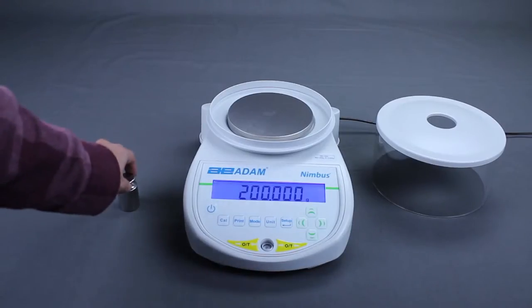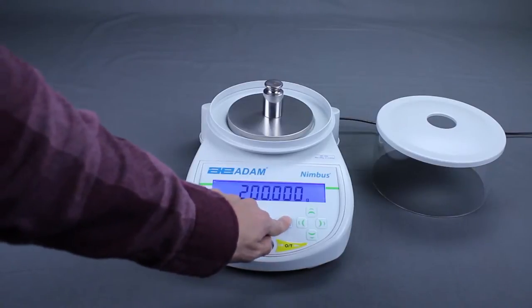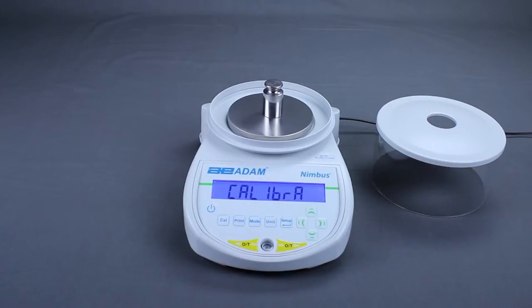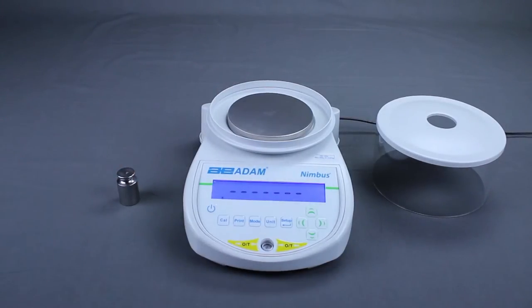Place the correct calibration mass on the pan, and press Setup Enter to continue. When calibration is complete, remove the mass, and the Nimbus will return to weighing mode.